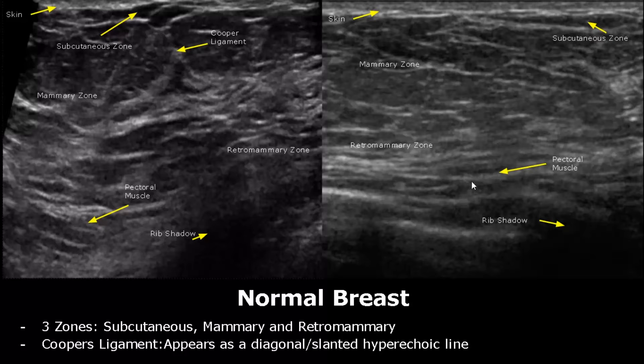The retromammary zone lies between the pectoral muscle and the mammary zone. It usually appears smaller because it is compressed due to probe pressure. This shadowing is due to the rib.